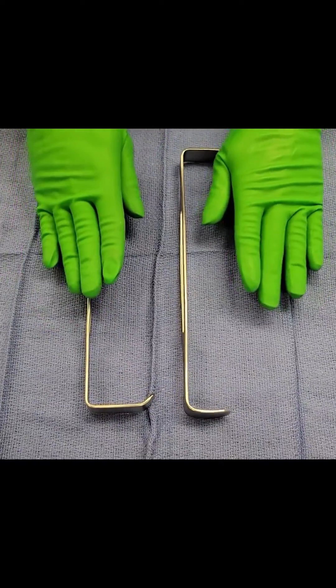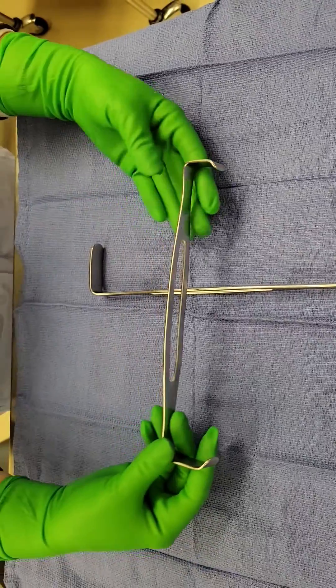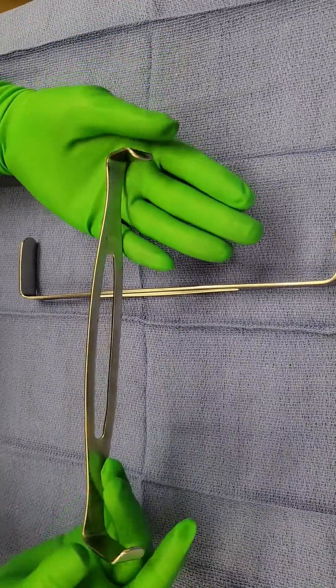Army-Navies are used to retract shallow or superficial incisions. And as you can see, there are two sides to it — a side that's longer and a side that's shorter.